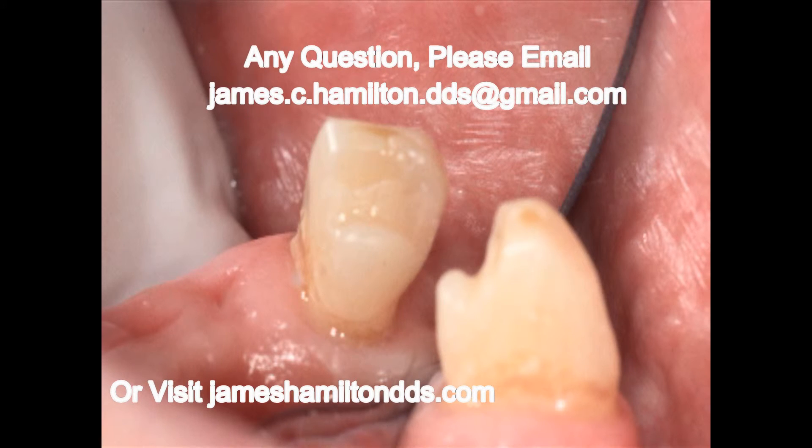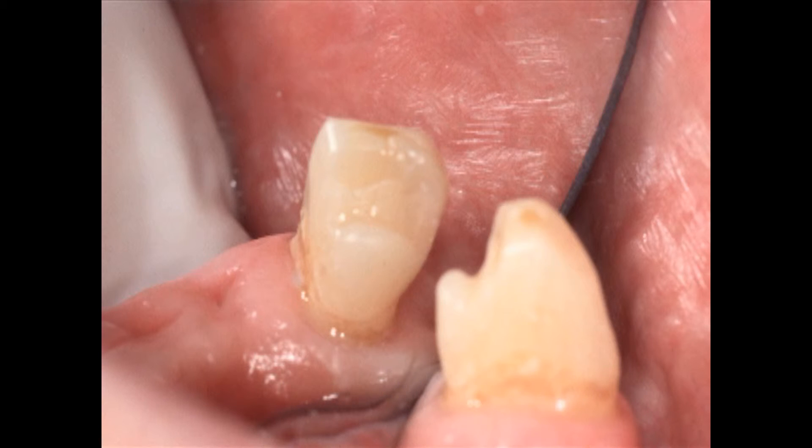We don't have to then go ahead and check the contours or check the draw. If we needed a guide plane in that area, we don't need to check it because it's already been reproduced from the impression we took. We've been doing this for about six or eight years and I've never found one that has failed. This is an easy way to take a virgin canine and, instead of doing a crown or inlay for a rest seat, to actually bond on a rest seat that perfectly fits your partial denture.